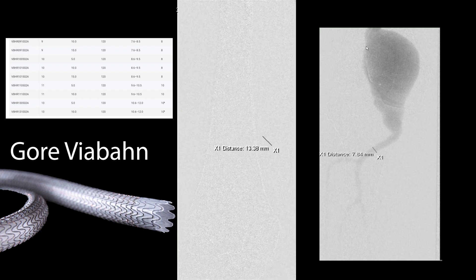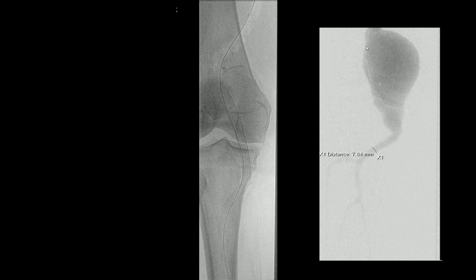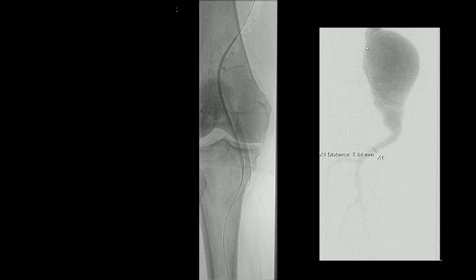We're not going to seal here because the biggest one in the matrix is 13 millimeters in diameter, and you can see it's already going to taper down more proximally. So we're going to come around that corner into the distal superficial femoral artery above the adductor hiatus, using an overlay in the background. You don't want to cheat on the overlap — we know we're going to put another one in, so there's no need to compromise overlap at all, because remember this is a mobile area and these can disconnect. It's important to have adequate overlap.